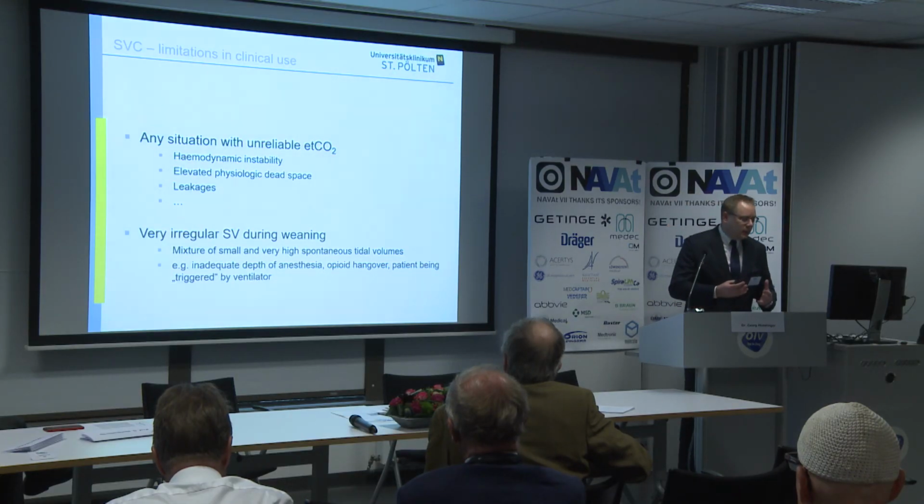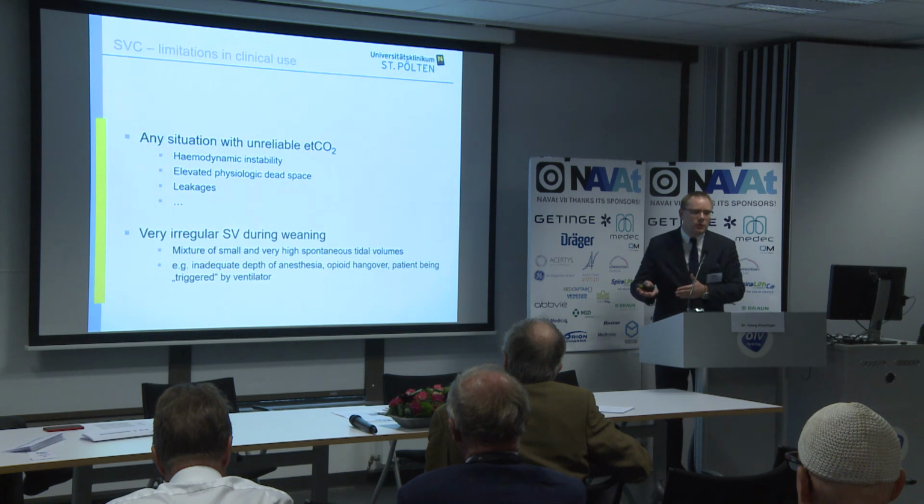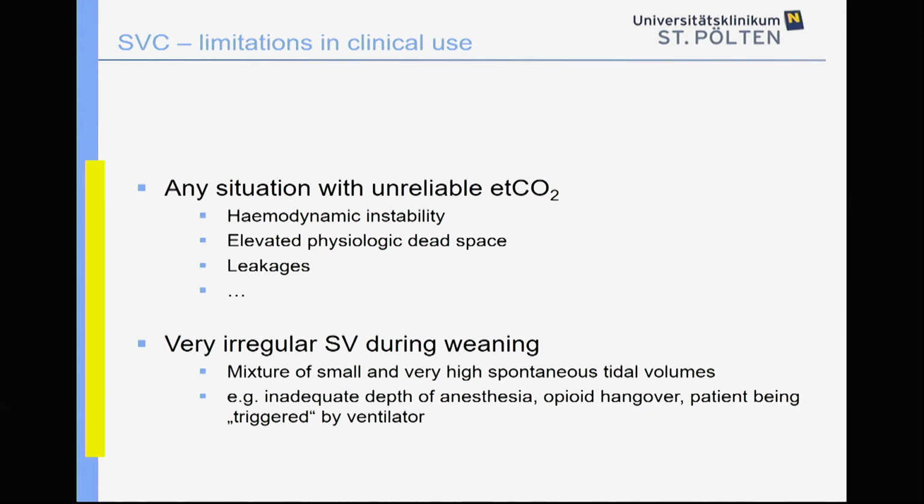And secondly, what also happens sometimes is, as I said, when you choose the wrong point of time for the transition from controlled to augmented spontaneous ventilation, for example, inadequate anesthesia depth or opioid overhang or whatever, patients might end up with very irregular spontaneous ventilation with some very small spontaneous breaths followed by huge spontaneous breaths, and this is also something which quite well mixes up smart ventilation control, and it has a hard time managing those irregular ventilation.